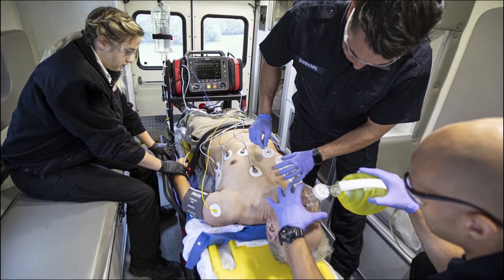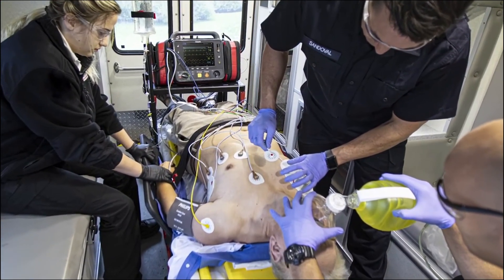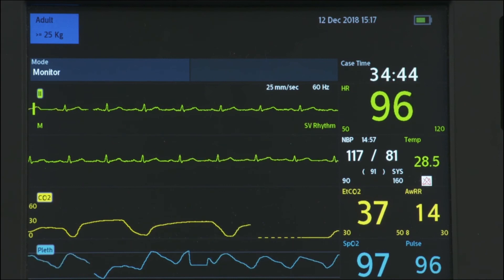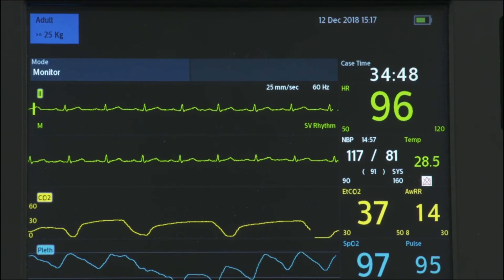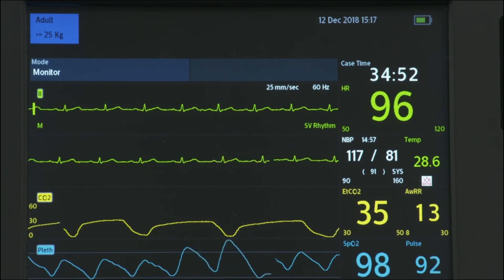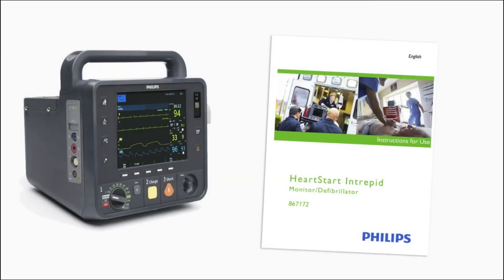No matter where you work, the HeartStart Intrepid can be configured to meet your clinical needs. For this program, we'll demonstrate operation using the default configuration settings. Be sure to familiarize yourself with your device's configuration before using the HeartStart Intrepid, and review the accompanying documentation, such as the instructions for use, for additional information about its operation.